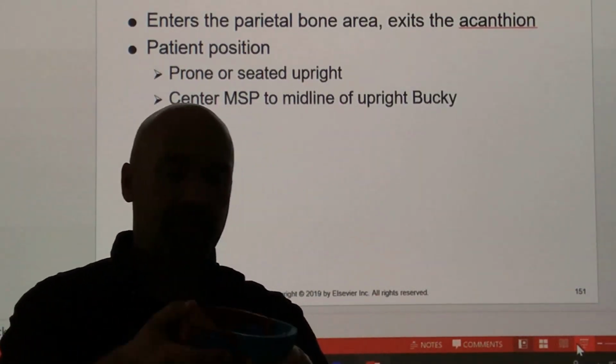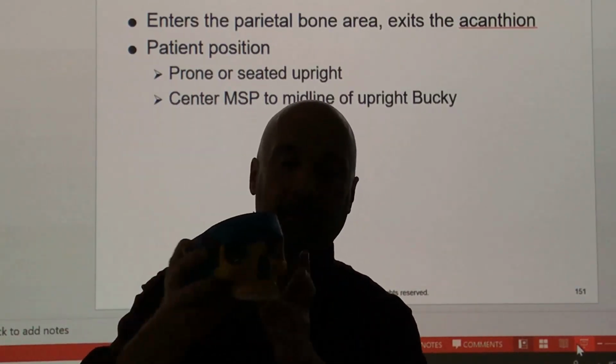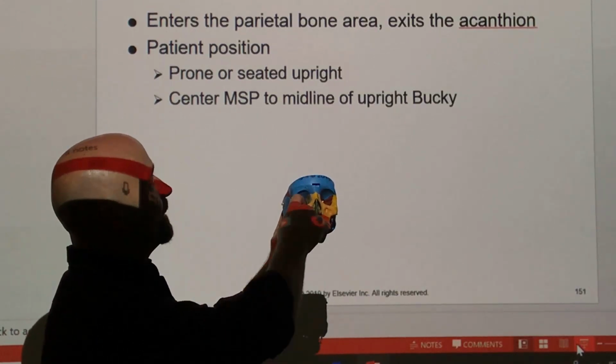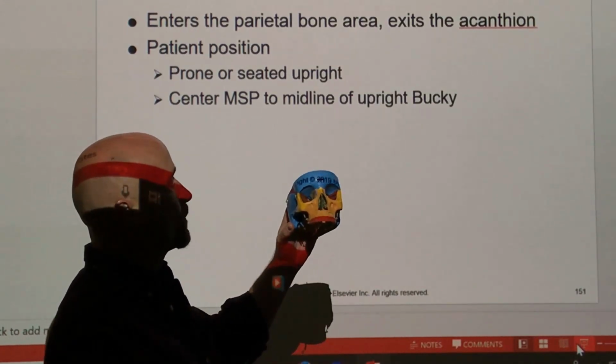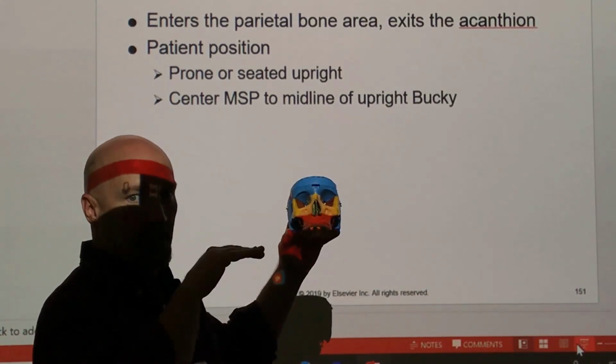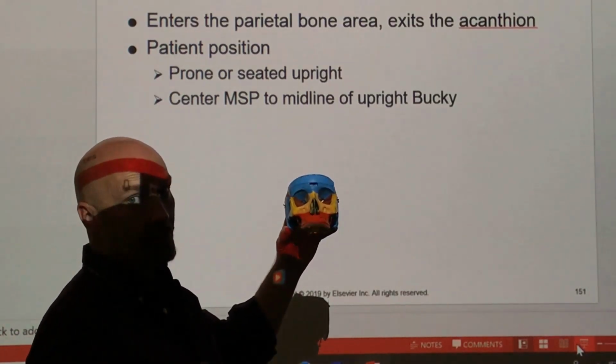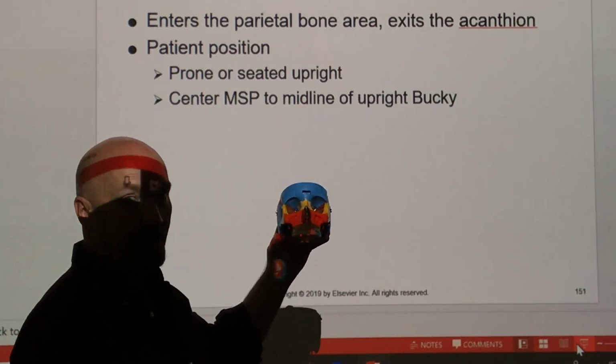By taking the patient's head and pulling it that far back, look at about that angulation right there. The floor of the orbit is pretty much perpendicular to your line of sight right now. Okay, so that's not a 37 Waters. That's what we call a 55 Waters.